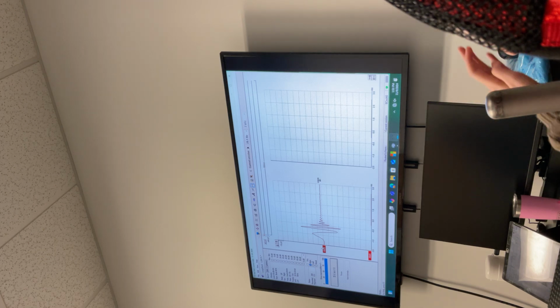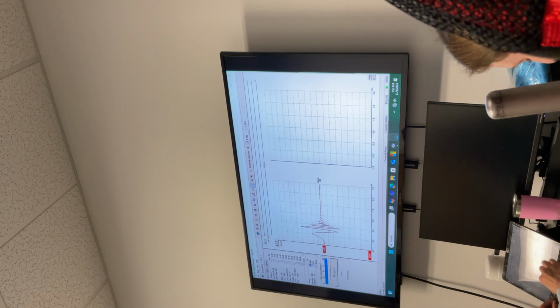So what you need to remember, one thing is, the chirp latency in the Eclipse system matches that of the click.